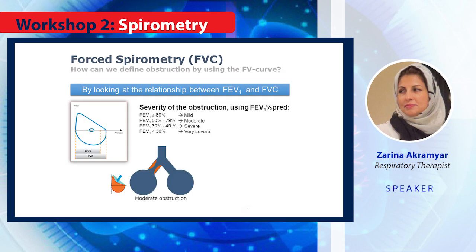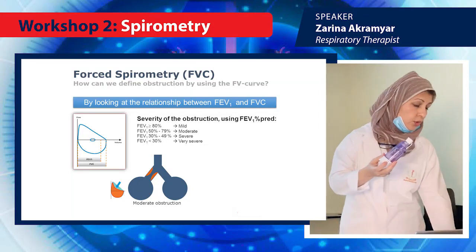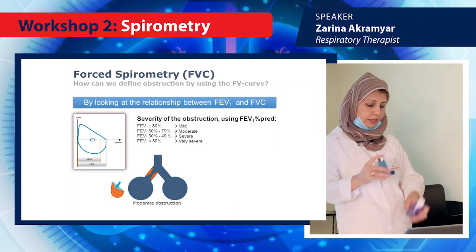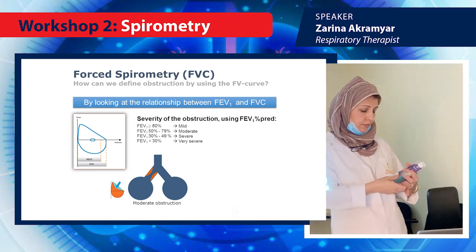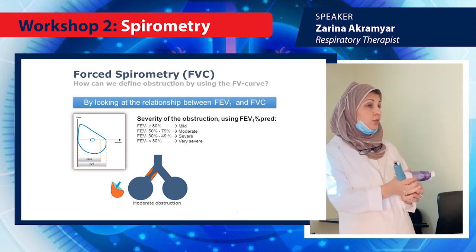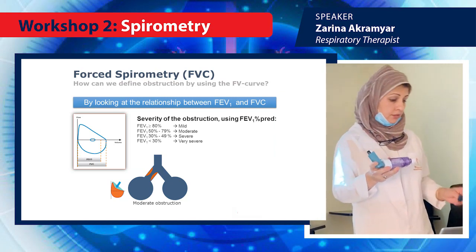So we stop that and we give a bronchodilator with this spacer. You can do it also in your lab, in your office. You just simply give the patient 2 puffs. I don't give the patient the inhaler and say take your puffers, because I don't trust their technique.